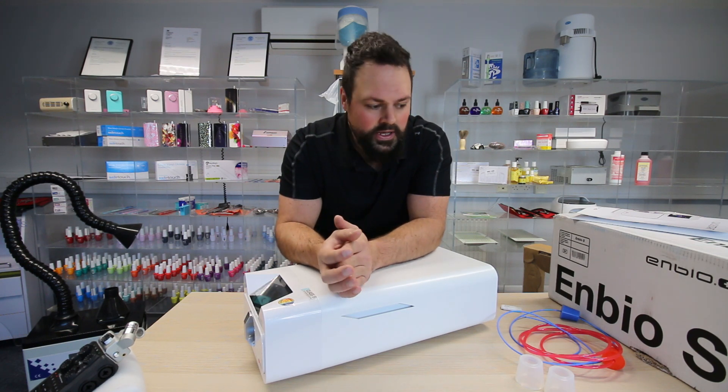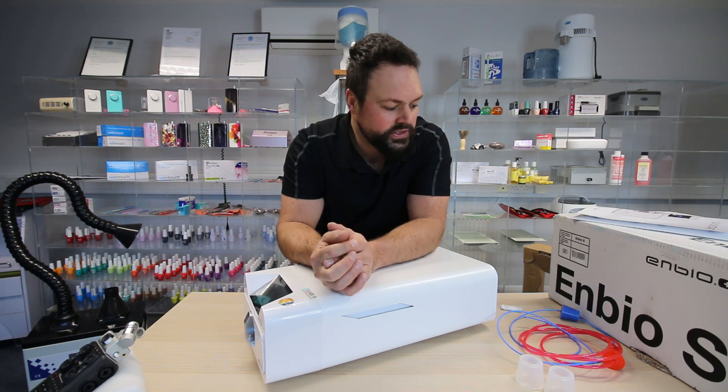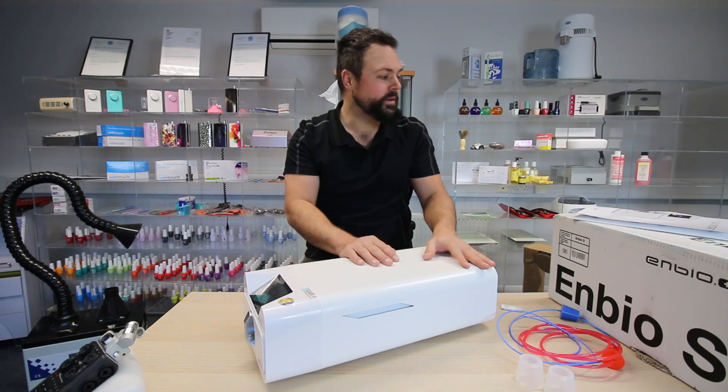Let's start from the top. What do you get in the box? How does it come packaged? Autoclaves are notoriously heavy usually. Deliveries are always cumbersome and big. You've got to have them installed, and it can be a two-man job. But this is most definitely a one-person job. This is the size of it — it's not overly big. I'll give you the dimensions shortly.